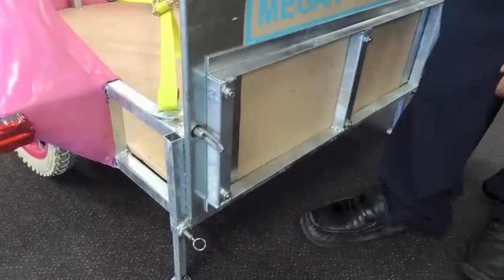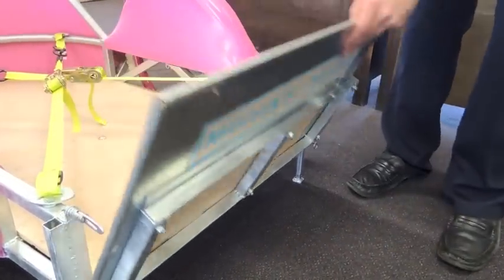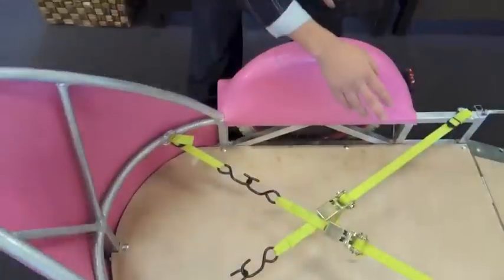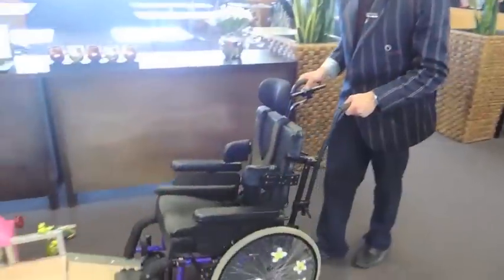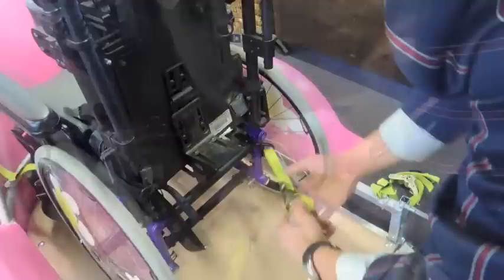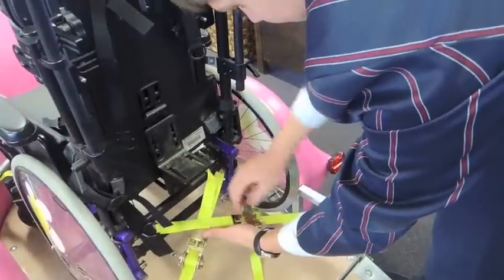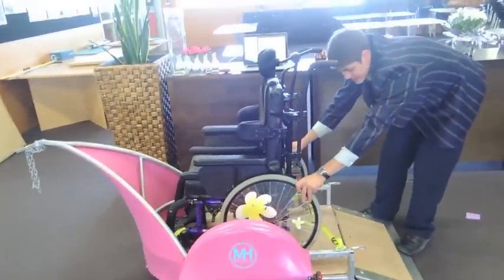Next, we flick open the drop locks and lower the ramp down. We will secure the wheelchair to four anchor points that can swivel to fit different wheelchairs. It is easy to roll on the wheelchair and connect it to the four tie-downs. The front two are fixed but can be adjusted by buckles. The rear two are crossover and tightened down. It certainly provides a very secure fit.